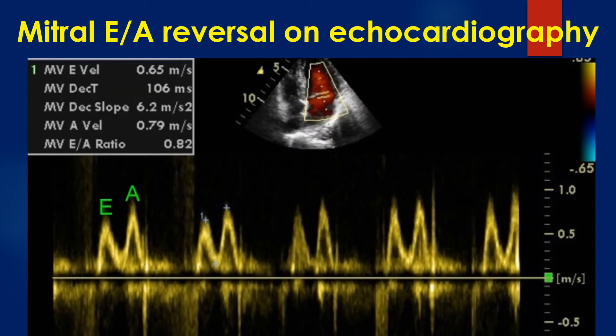Conventional Doppler assessment of transmitral flow showing E by A reversal in left ventricular diastolic dysfunction. MVE: early mitral inflow velocity; MVDCT: deceleration time of early mitral inflow velocity; MVD slope: deceleration slope of mitral inflow velocity; MVA: mitral inflow velocity during atrial systole; MVE by A ratio: ratio between early mitral inflow velocity and atrial systole mitral inflow velocity.